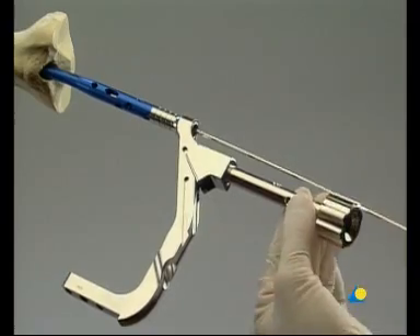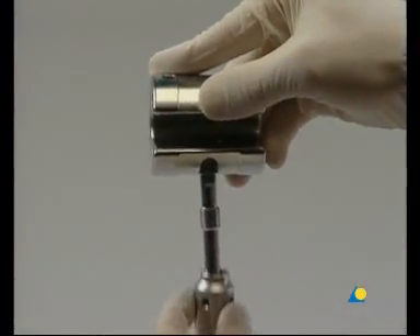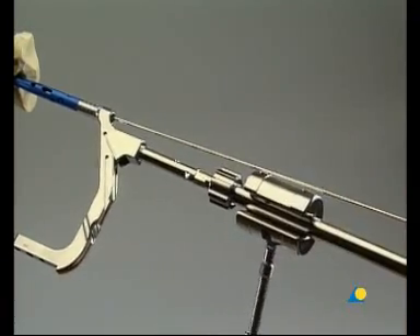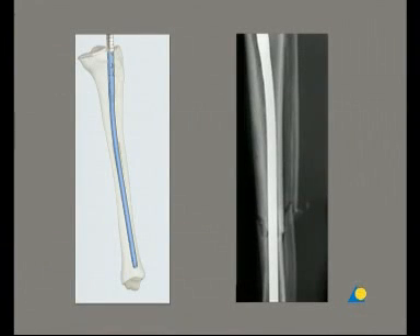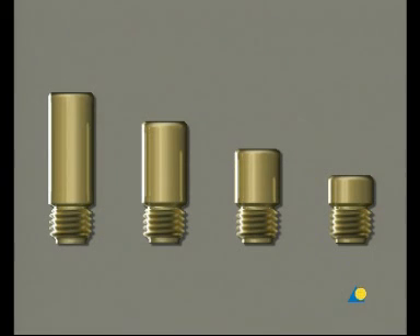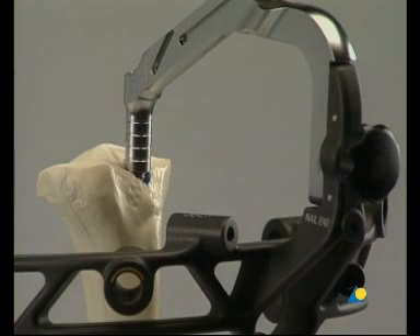The connector is secured to the insertion handle. The hammer is used in the fixed mode. If more insertion force is necessary, the hammer guide is attached to the connector, and the hammer is used in the sliding mode. The final position of the nail is verified in the AP and lateral views, with the guide wire placed in the aiming arm. The insertion handle is marked in 5 millimeter increments, which correspond to the extensions of the end caps, and can be used for over-insertion of the nail or for correcting the nail length. If primary compression or secondary dynamization is planned, it is recommended to over-insert the nail up to 7 millimeters, which corresponds to the maximum distance between the positions in static and dynamic modes.